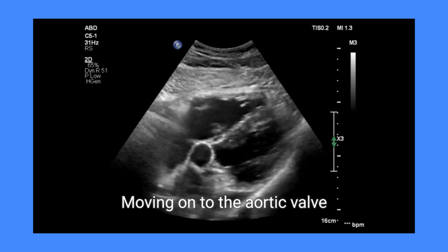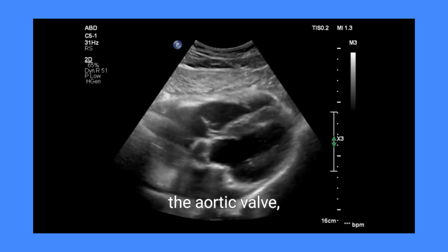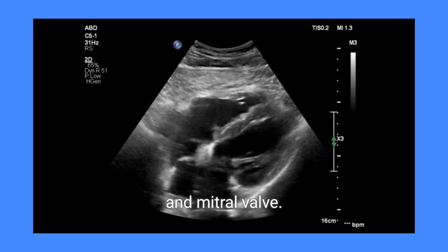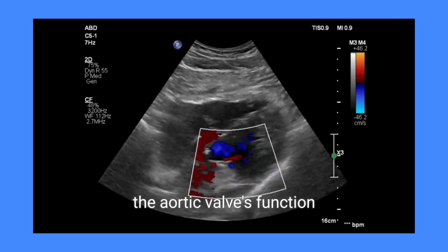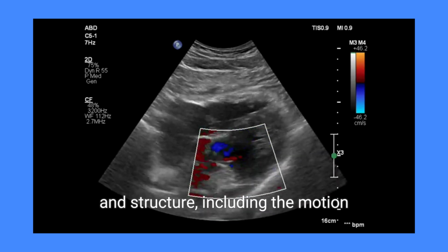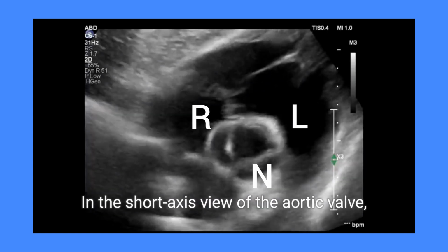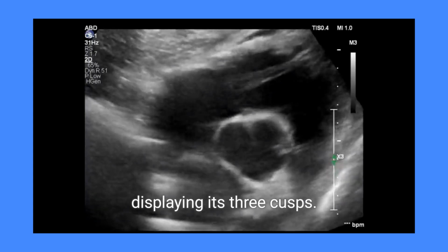Moving on to the aortic valve, five-chamber view, which encompasses the aortic valve, LVOT, left atrium, left ventricle, and mitral valve. This view is important for assessing the aortic valve's function and structure, including the motion and closure of its cusps. In the short-axis view of the aortic valve, we get to see it in cross-section, displaying its three cusps.